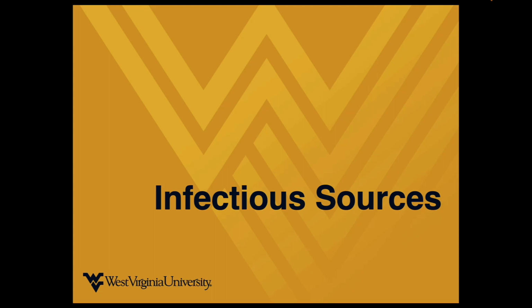We've gone through the first couple of questions from a physiologic perspective. Is there an obstructive component to their shock? Is there a cardiogenic component? Then we asked ourselves, okay, it doesn't look like it's one of these, or it's not primarily one of these. Is there a hemorrhagic source? And we looked at those. And now we're going to look at, is there an identifiable infectious source?